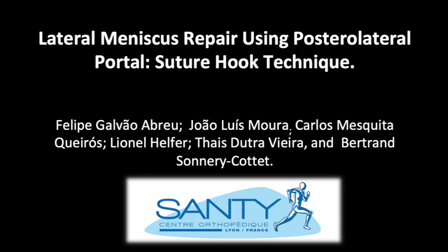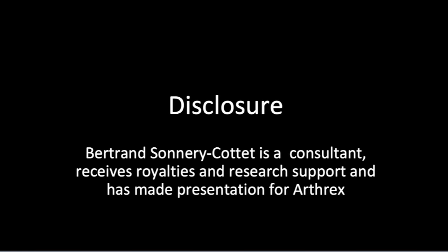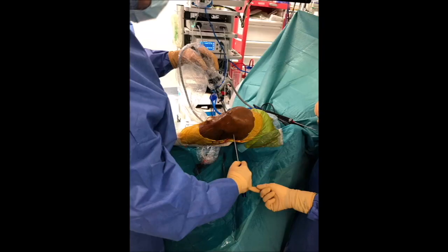This video demonstrates a lateral meniscus repair using a posterolateral portal. In this technique, a suture hook is used as a tool to place vertical sutures repairing longitudinal tears of the posterior horn of the meniscus.